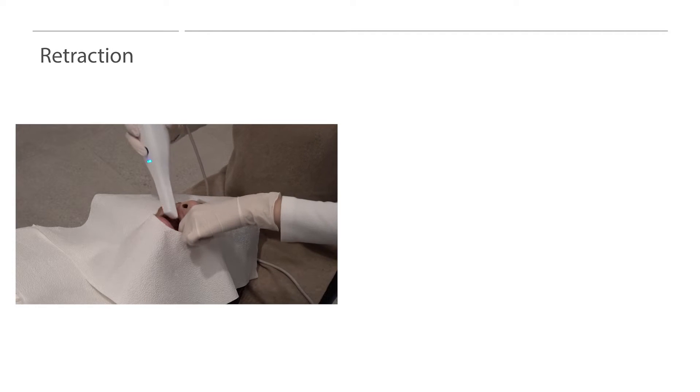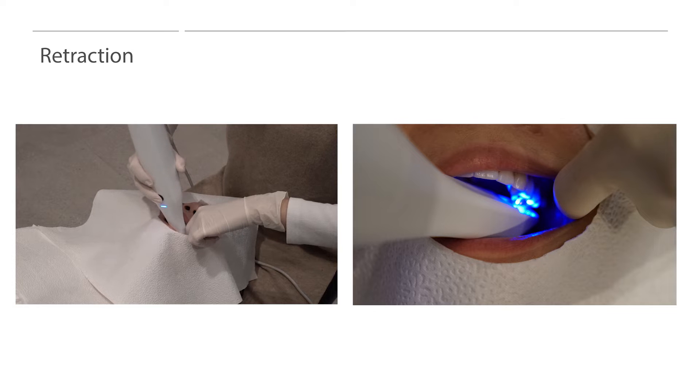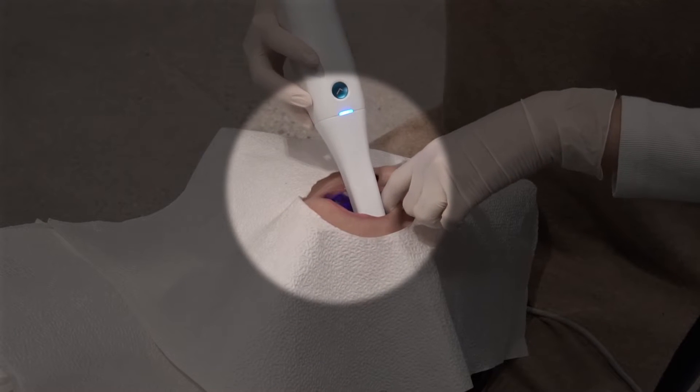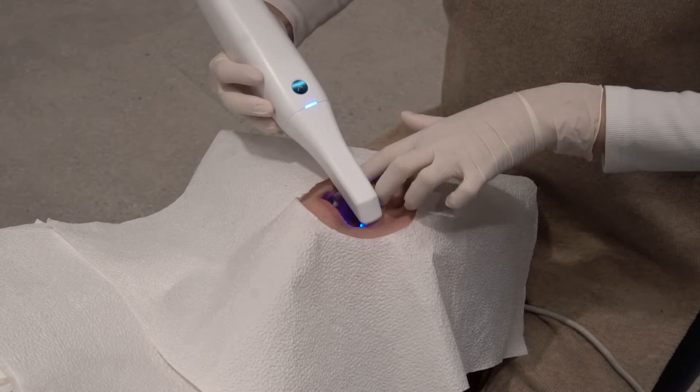Once users find a comfortable position, they will need to properly retract to get accurate scans. Retraction is intended to minimize soft tissue obstruction. With proper retraction, the scanner can get the most accurate intraoral scan data. One way to retract is by making a hook shape with the index finger. Users can retract the cheeks with the index finger and place the scanner on the occlusal surface. Users will have to move the index finger in the same direction the scanner is moving. This will create ample space between the scanning area and the soft tissue.